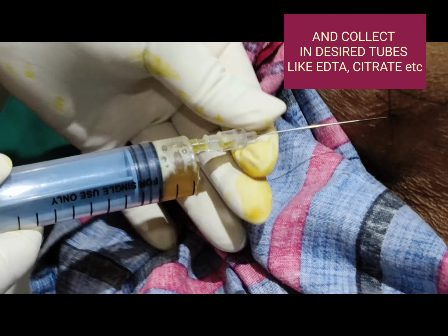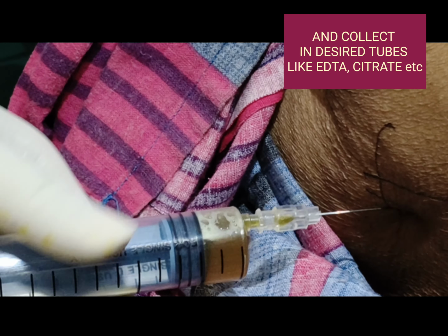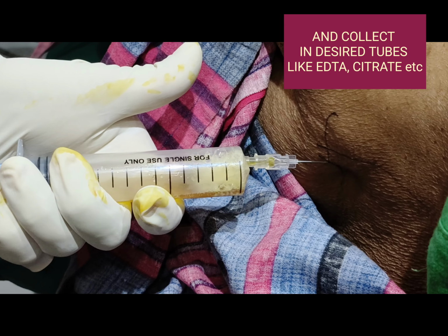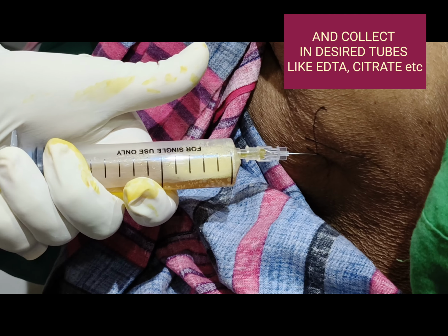After collection of the fluids, in the meantime, the local anesthesia will do its job, and the area of the biopsy will be desensitized, so the biopsy will be very easy.